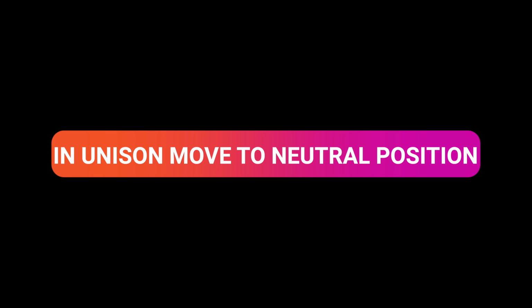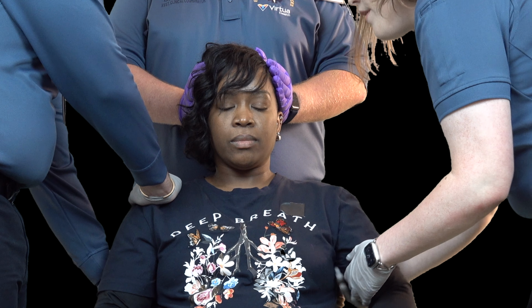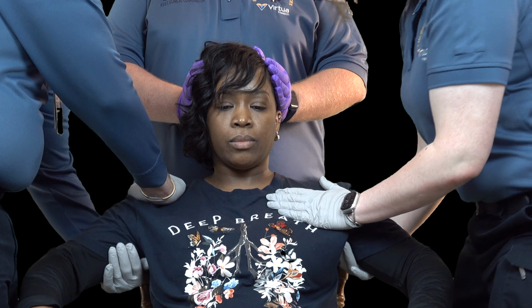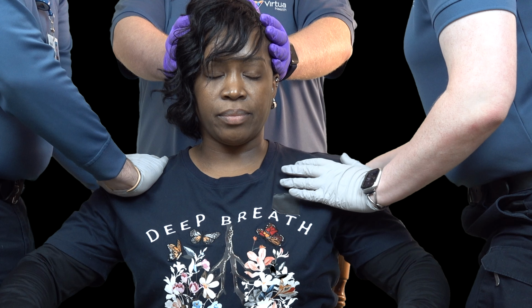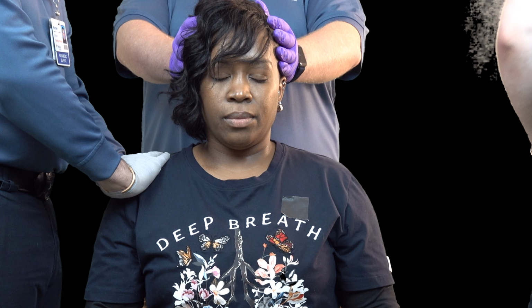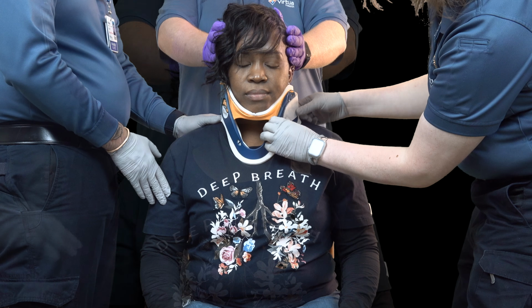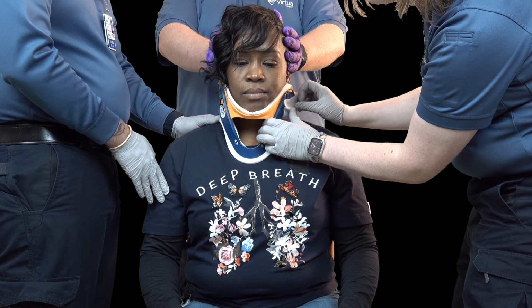We need to move the patient into a neutral inline position. Do this by placing one hand on the front of the patient's chest to keep them from moving too far forward. The other hand should grip under the patient's armpit, and at the same time, you and your partner should lift straight upwards, keeping the spine in line. After, measure and apply a cervical collar to the patient.